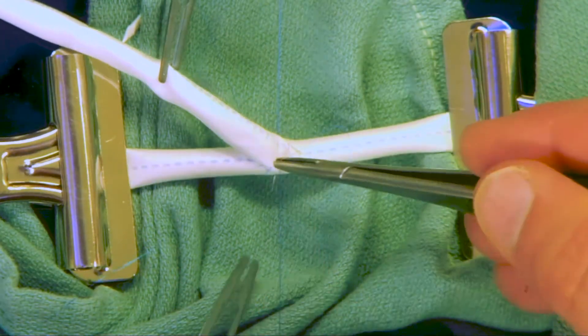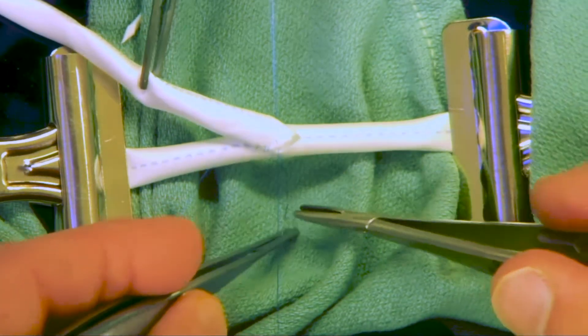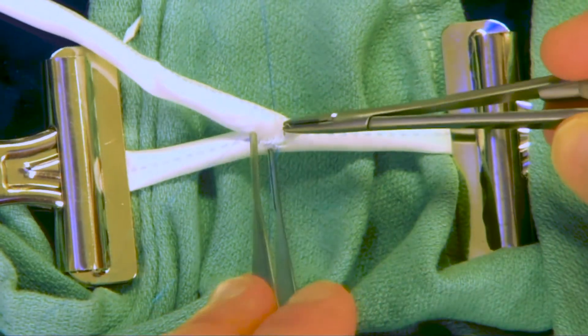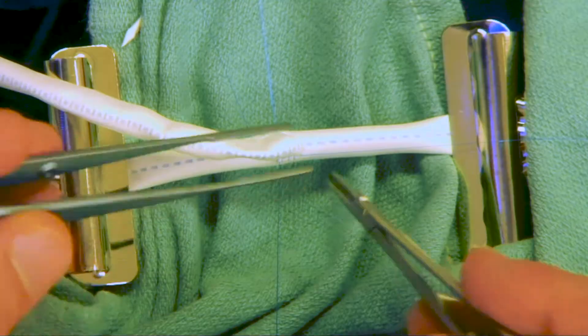Try to really focus on having all the action happen in the field of the anastomosis, meaning that we're loading the needle and going back and forth right there in the field rather than passing the suture off the field and loading somewhere else that's outside the view of the anastomosis.